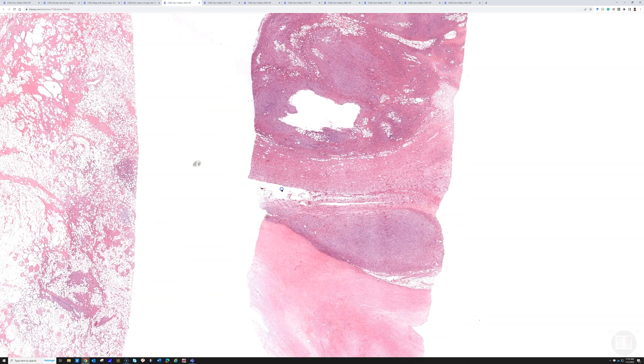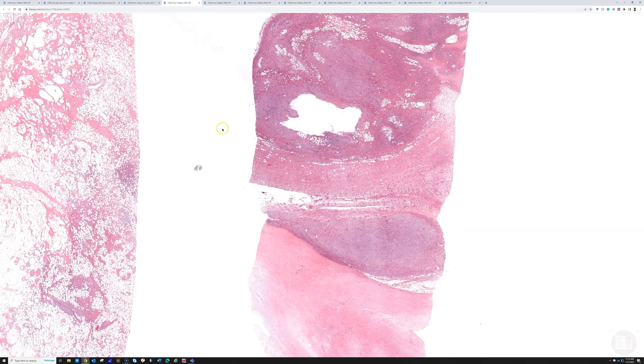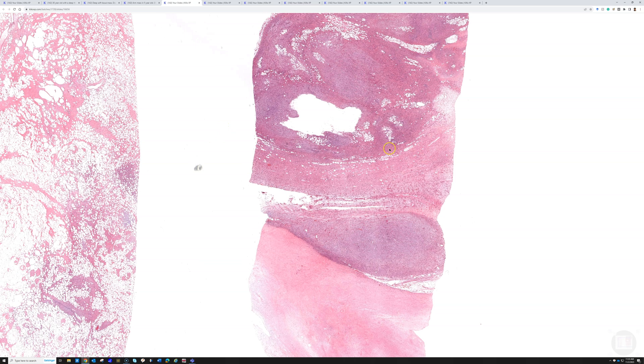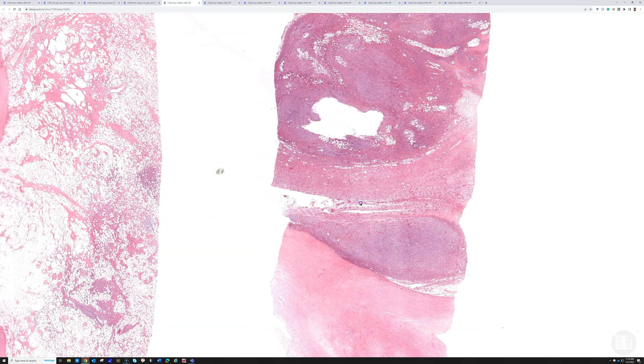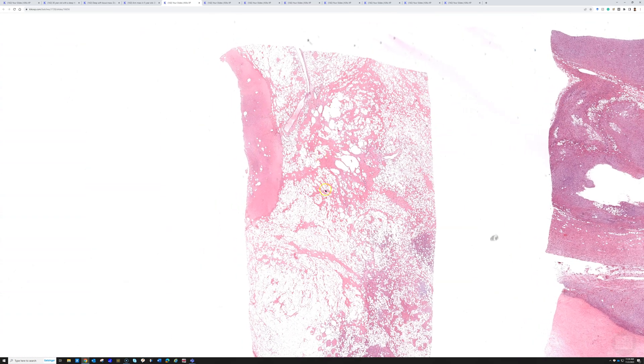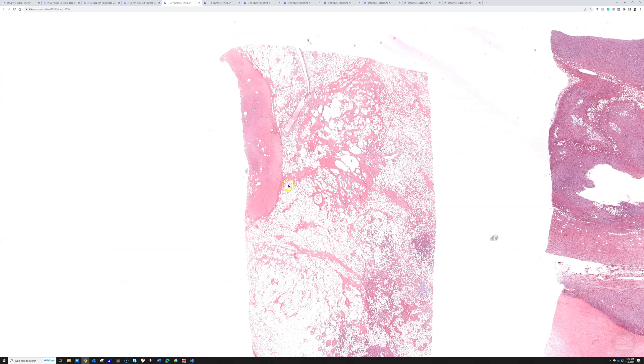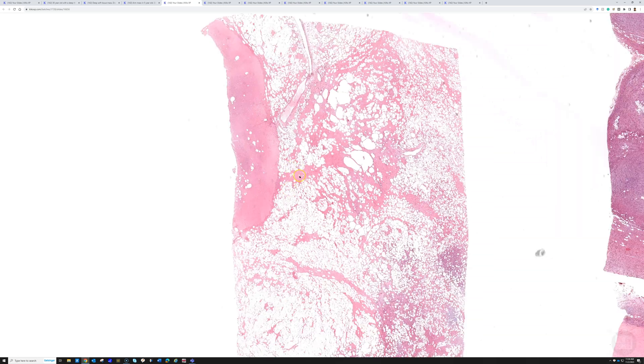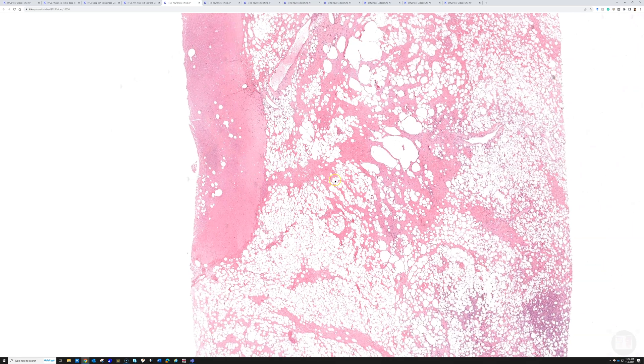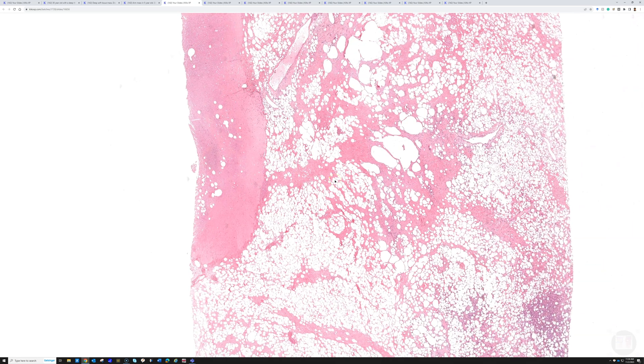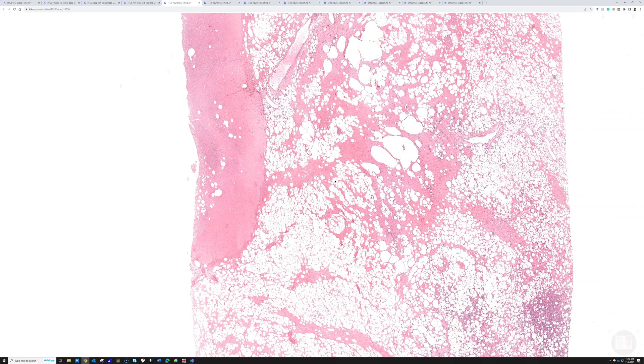In this case, we can tell the answer is de-differentiated liposarcoma because we have a high-grade sarcoma plus, right next to it, well-differentiated liposarcoma. If well-differentiated liposarcoma were in the extremities, we would call it atypical lipomatous tumor. It's the same tumor, different name, with better prognosis there.